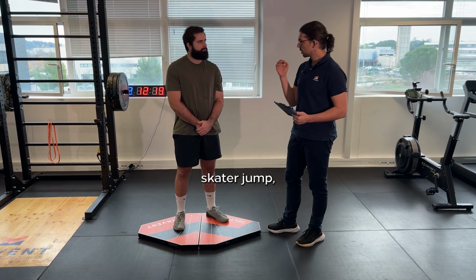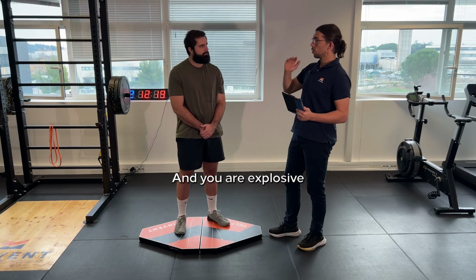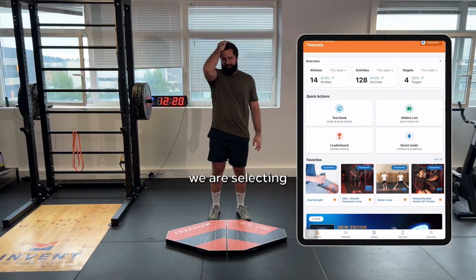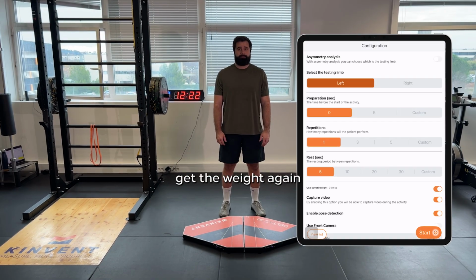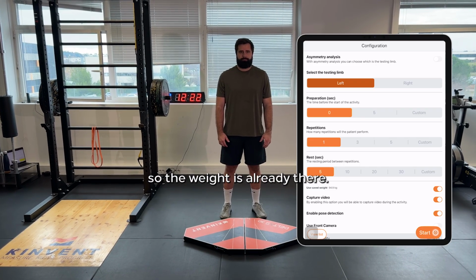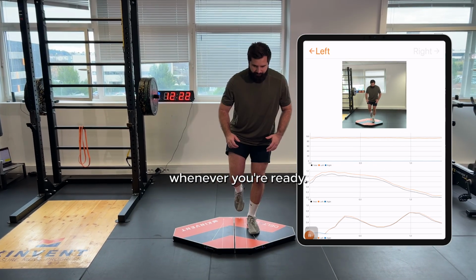Now Loic, skater jump, you place yourself on one foot, okay? And you are explosive, jumping to the side, okay? We are selecting the skater jump, starting our protocol, check, next. We don't need to get the weight again because we did some earlier test plyometrics with Loic, so the weight is already there. Loic, step on your left foot. Whenever you're ready, go.